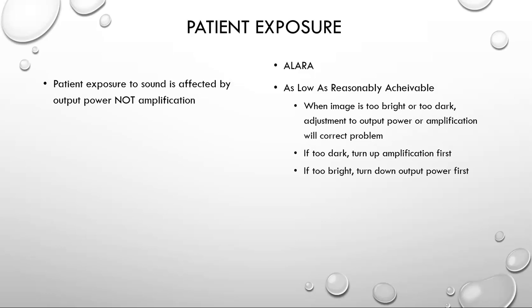We always want to remember the term ALARA, which means as low as reasonably achievable. When the image is too bright or too dark, an adjustment to the output power or amplification will correct the problem. If it's too dark, you always turn up the amplification first. If it's too bright, the best practice is to turn down the power first.